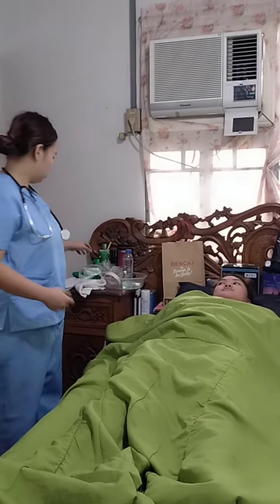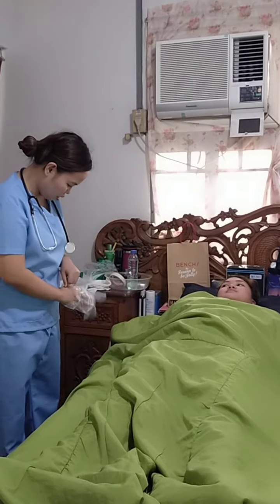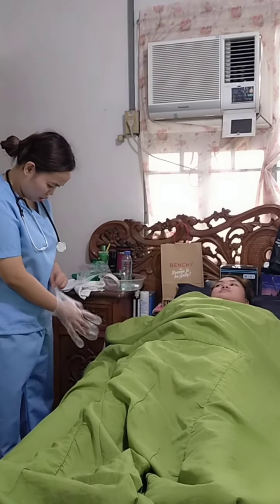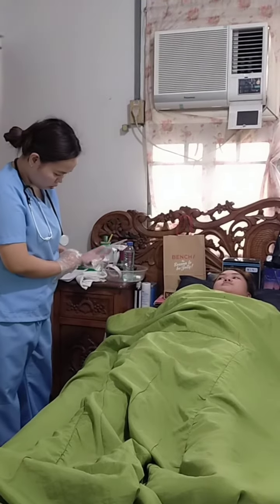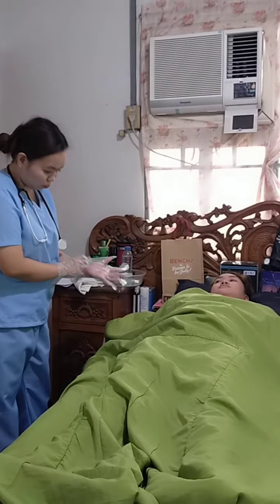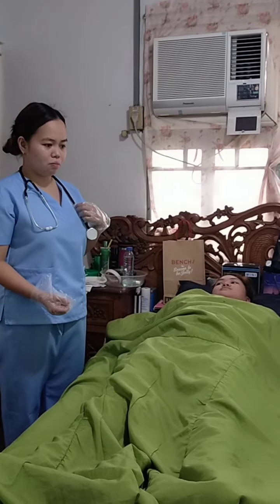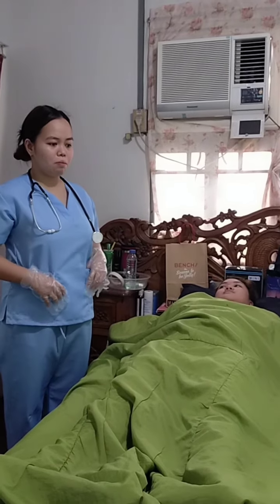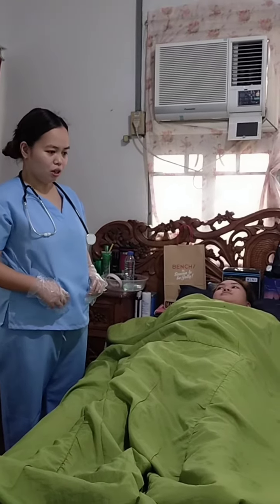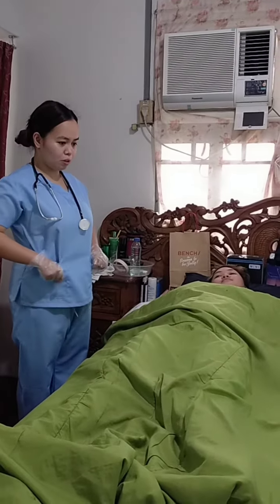Perform proper hand hygiene and wear disposable gloves. Now I'm going to wear the disposable gloves. This prevents the spread of microorganisms. Then assess the client in high Fowler's position, over 45 degrees. If the client is unable to maintain the upright position, place her in a semi-Fowler's position.